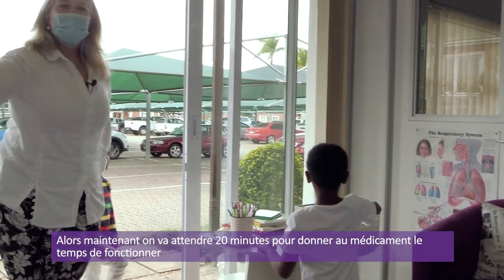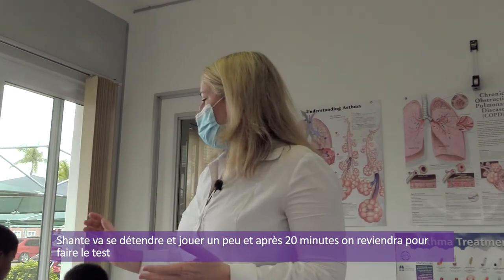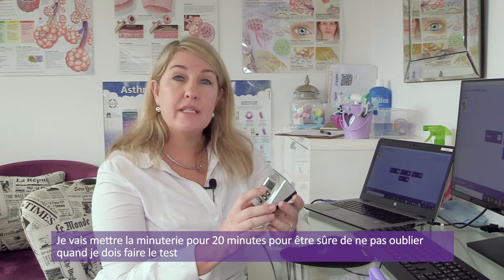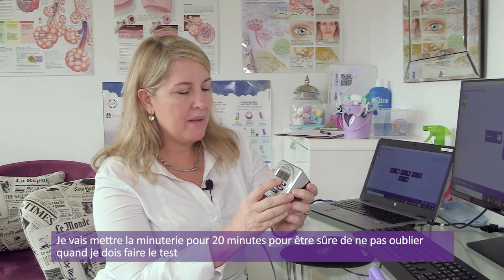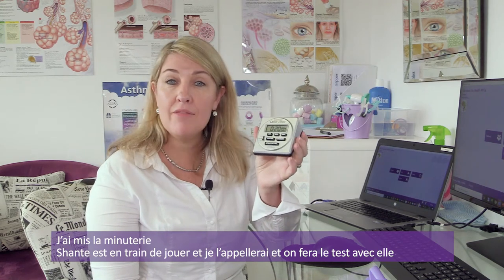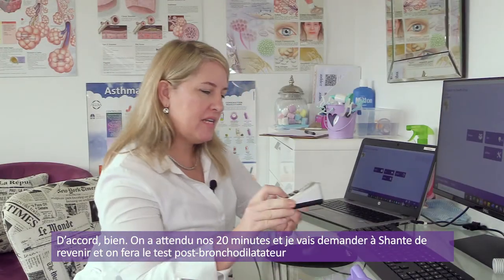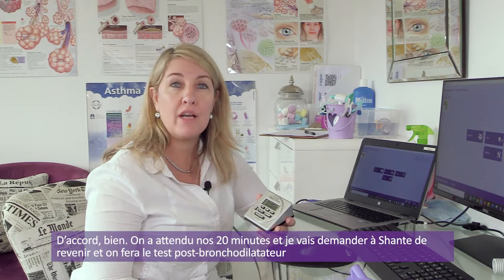Okay. So now what we're going to do is wait 20 minutes for the medication to take effect. Shanti will just relax and play for a while, and then after 20 minutes I will bring her back and I will do the bronchodilator test. Now I'm going to set the timer for 20 minutes just to make sure that I don't lose track of time. Shanti is now playing, and I'll call her back as soon as we count down. All right, good. So 20 minutes has passed and I'm now going to bring Shanti back to do her post-bronchodilator test.